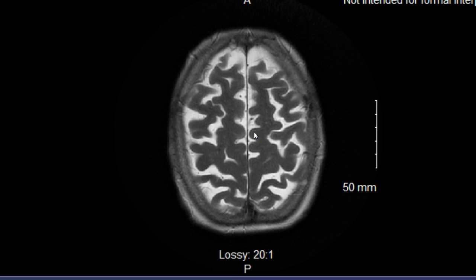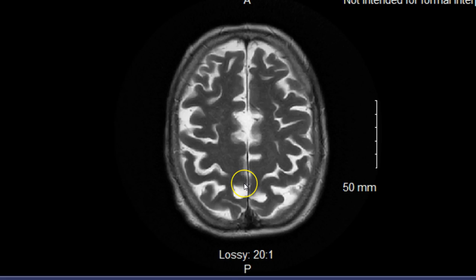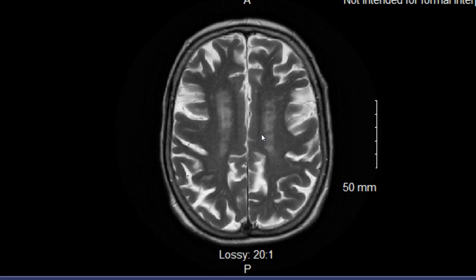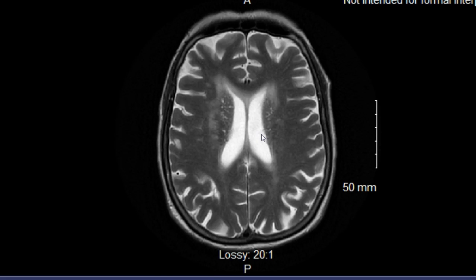So what we're seeing here is an axial orientation. It's a T2 scan. You can tell it's a T2 scan, really, just like I said in the lecture. Just start to look at those ventricles, and you can tell those ventricles are really bright. And you can subsequently see them extremely, extremely well on this particular patient. So looking at those, you can see definitely the lateral ventricles.